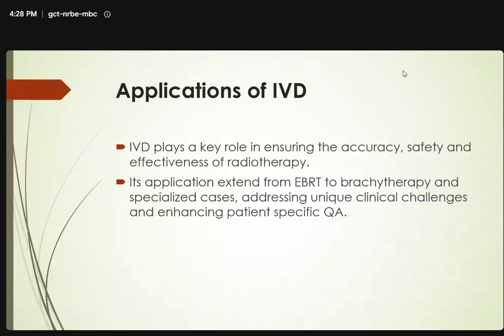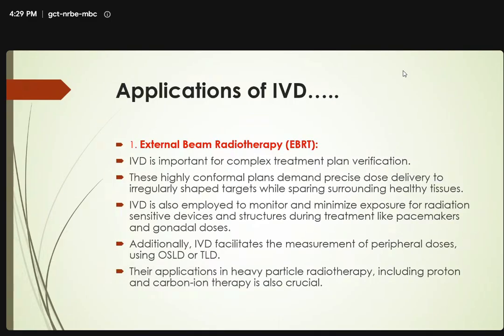In vivo dosimetry plays a key role in ensuring the accuracy, safety, and effectiveness of radiotherapy. Its application extends from external beam radiotherapy to brachytherapy and specialized cases addressing unique clinical challenges and enhancing patient-specific quality assurance products. So, in case of external beam radiotherapy, the application of IVD is there.